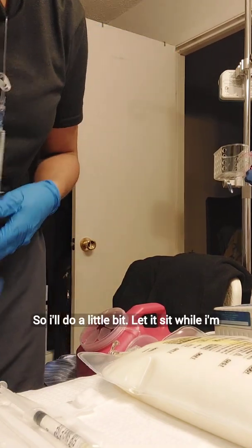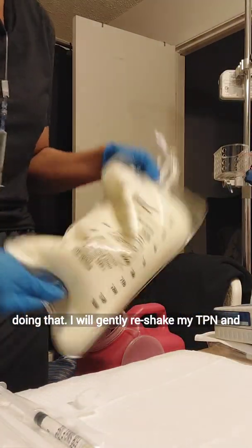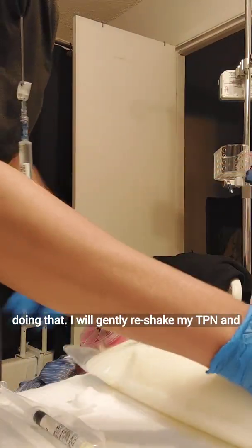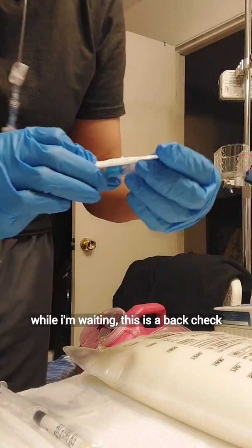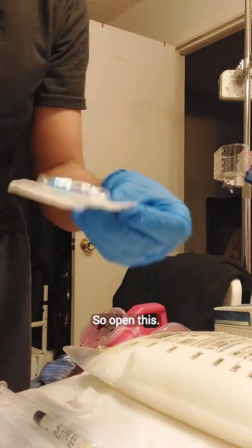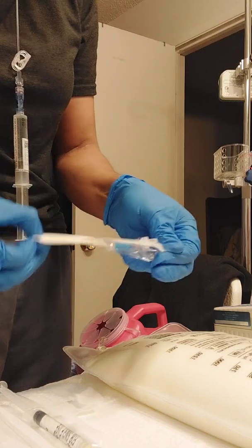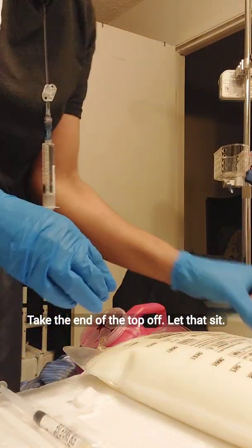So I'll do a little bit, let it sit. While I'm doing that I will gently re-shake my TPN. And while I'm waiting — this is a back check valve — open this, take the end of the top off, let that sit.